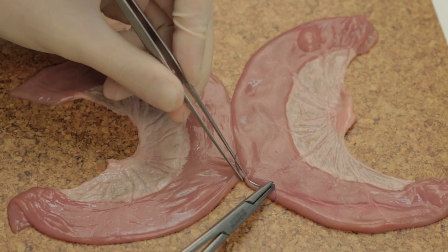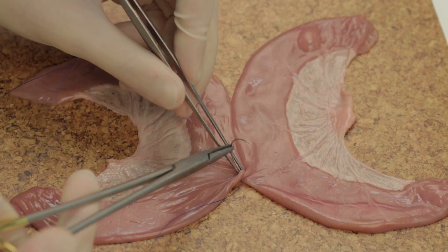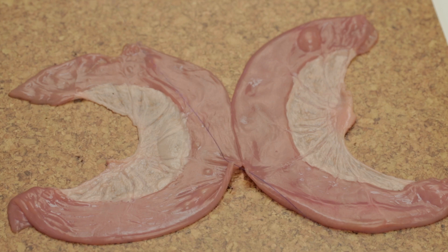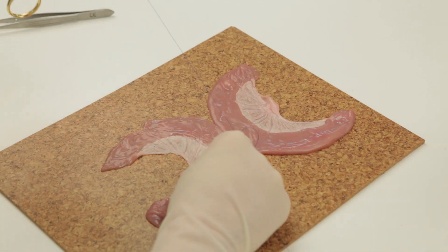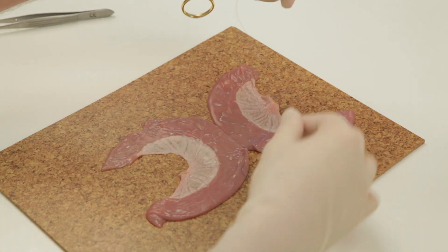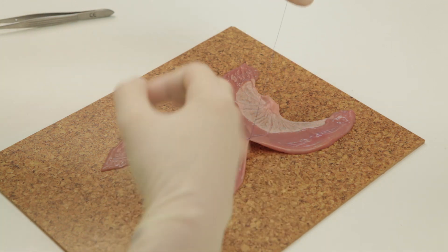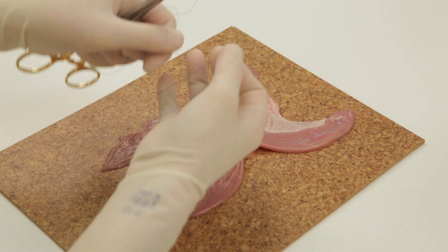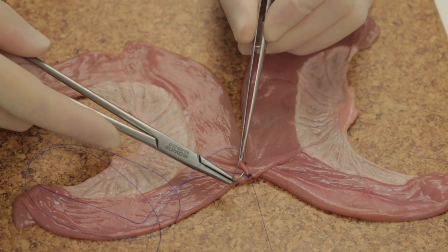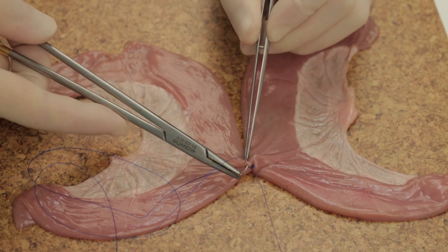Lay the segments to be joined side-to-side in contact for 10cm or so. Using double-ended 2-0 PDS, unite the two segments of bowel with a seromuscular stitch, tying a secure knot and applying a clip to one of the needles. Insert a continuous layer of seromuscular sutures. This is the posterior outer layer of the anastomosis.